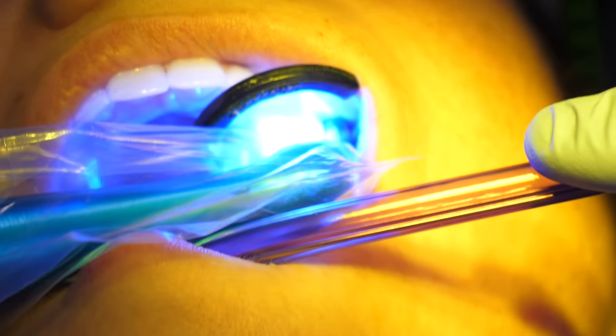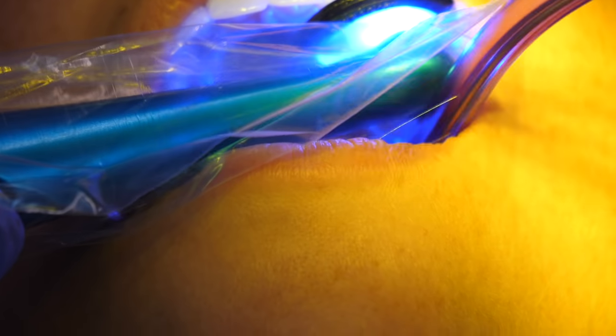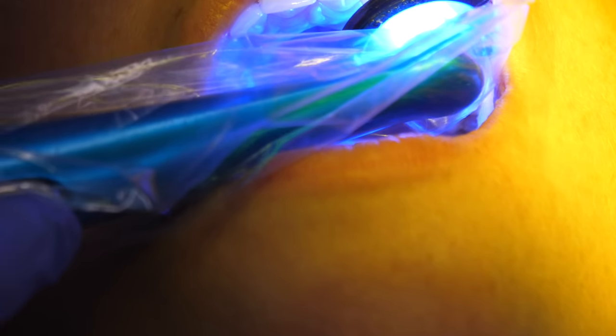The dental assistant may leave the saliva ejector in the corner of your mouth throughout this process, or they may put it in and out throughout the procedure, but either way, you'll mostly hear lots of suction noises during the appointment.